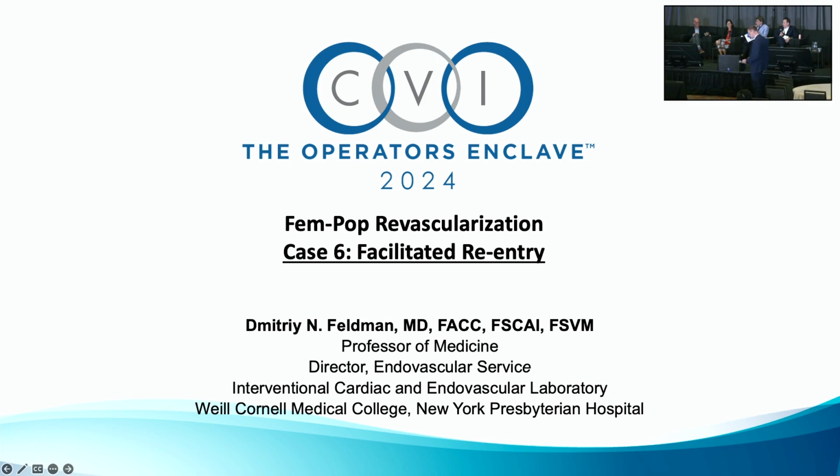The mechanism, orbital atherectomy embolizes more than anything, and it's for calcium. So would I put an orbital atherectomy in? No, I'd pick any device but orbital atherectomy personally. Yeah, I mean to ablate your stent. I don't think you're going to ablate it. I think you're going to maybe get it stuck somewhere or do something bad. I wouldn't. That's an F no for me.